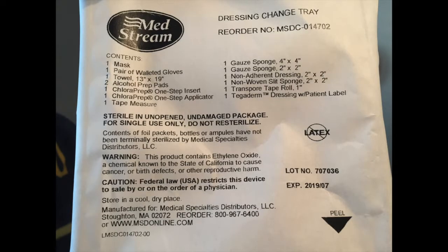Now, this is the patch changing kit — it comes with everything you really need for a patch change, except your actual patches. When you have central lines, PICC lines, and similar lines, you get your supplies that way, and your patches will come in separately. This is the dressing changing tray, and it comes with a mask, gloves, and a bunch of other stuff for a patch change.